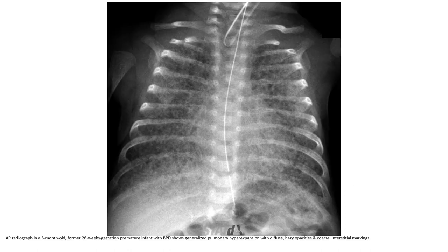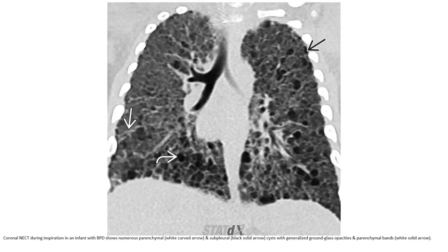This is the chest radiograph in a five-month-old former 26-week gestation premature infant with bronchopulmonary dysplasia, showing generalized pulmonary hyperexpansion with diffuse haziness and coarse interstitial markings. Non-contrast enhanced CT in inspiration in an infant with bronchopulmonary dysplasia shows numerous parenchymal and subpleural cysts with generalized ground glass opacity and parenchymal bands.